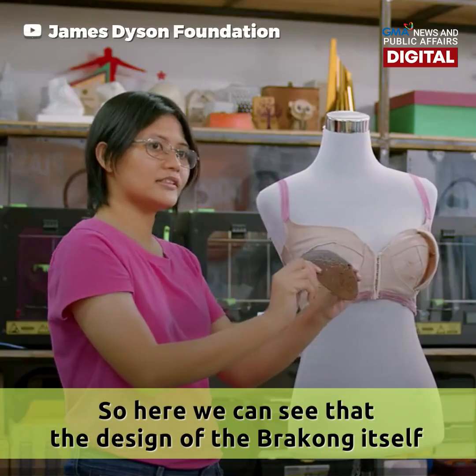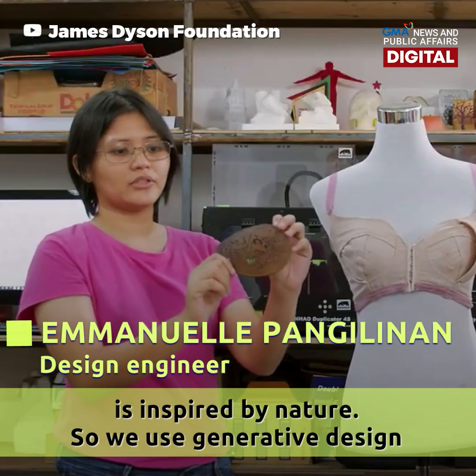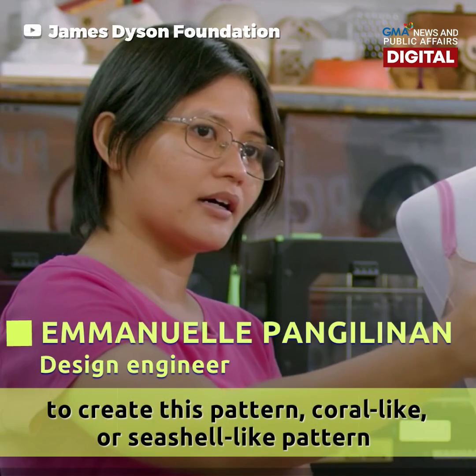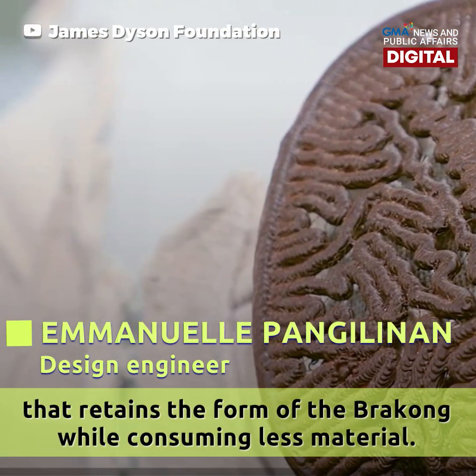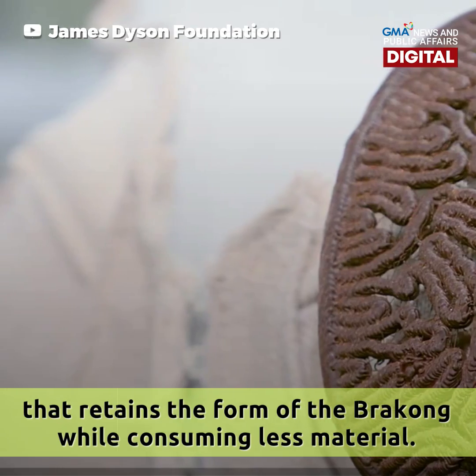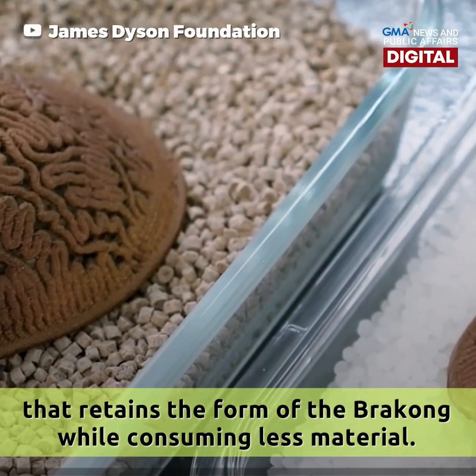Here we can see the design of the brakong itself is inspired by nature. We use generative design to create this coral-like or seashell-like pattern that retains the form of the brakong while consuming less material.